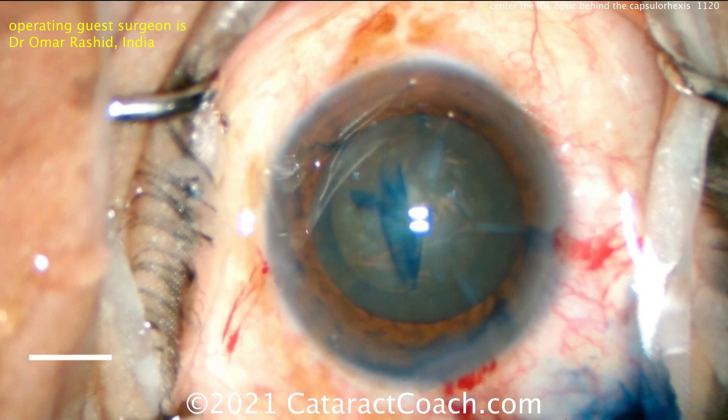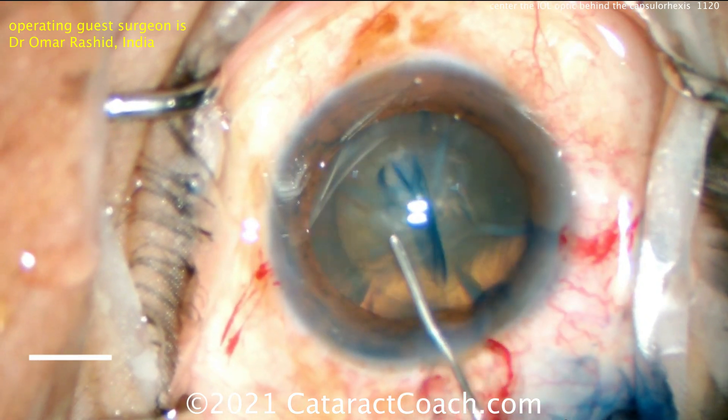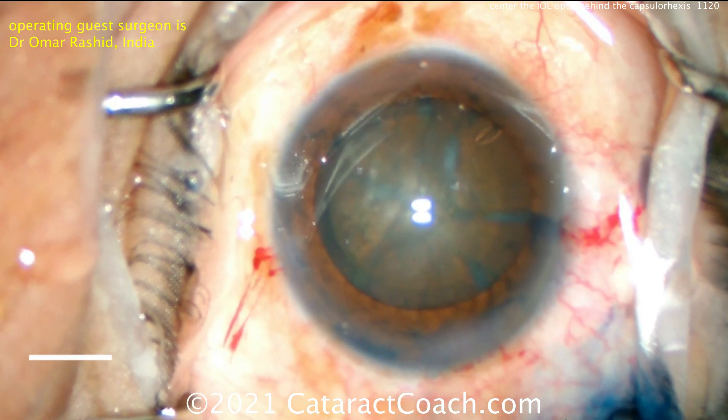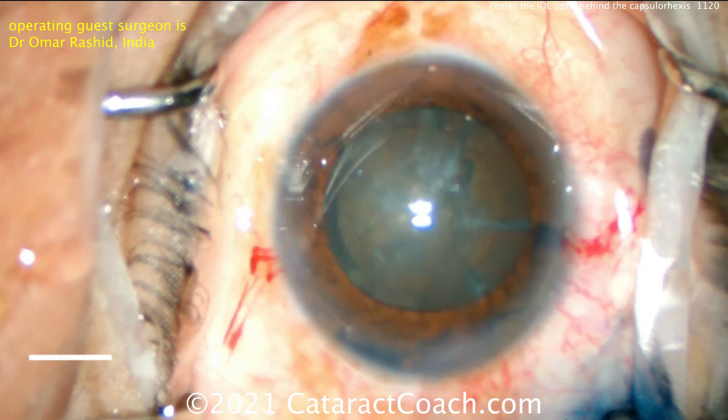Now, you may want to consider using marks on your forceps. You can use those same forceps — just get a keratome, a steel keratome that you're going to throw away, and mark a two-and-a-half millimeter or a five millimeter mark on the arm of the forceps. So you can figure out what size rhexis you're making.